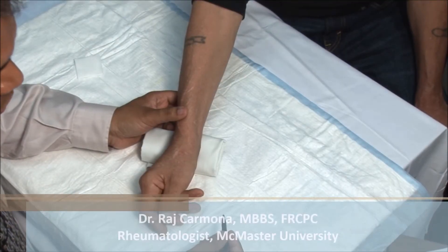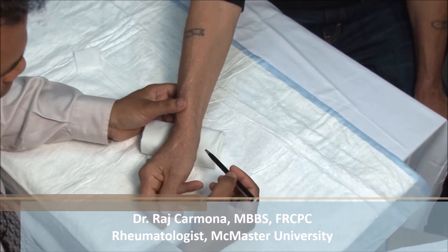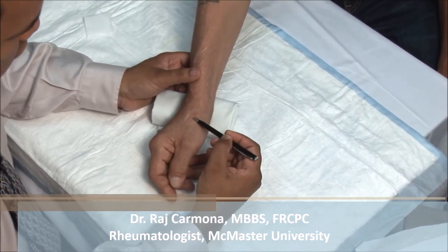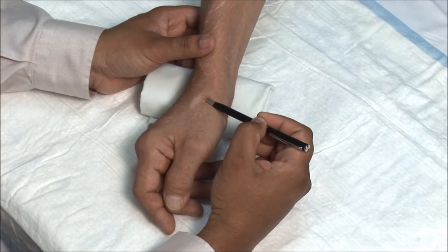The first CMC joint is frequently affected by osteoarthritis. The joint is located between the proximal tip of the first metacarpal and the trapezium, just at the distal border of the anatomic snuff box.